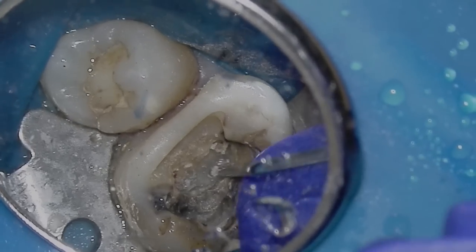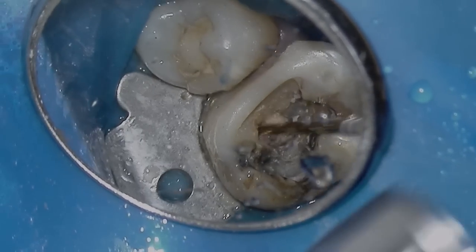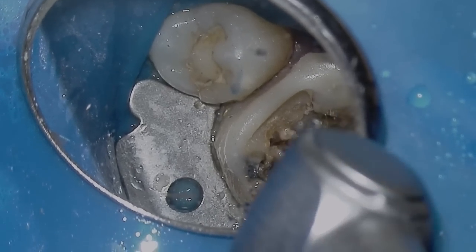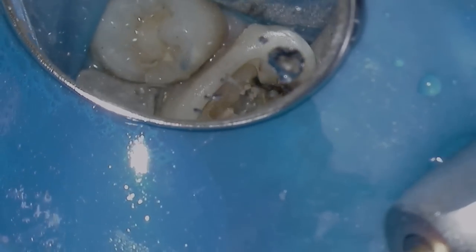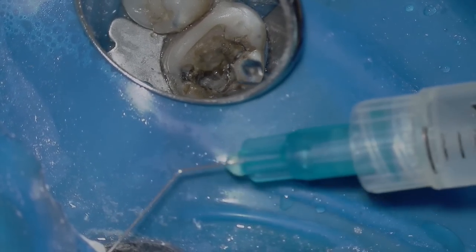Now I've exposed the main canals — the mesial buccal, distal buccal, and palatal — and I'm going to use my WaveOne Gold Primary to open up all the orifices. Irrigation throughout the entire process, as we all know, is super important.